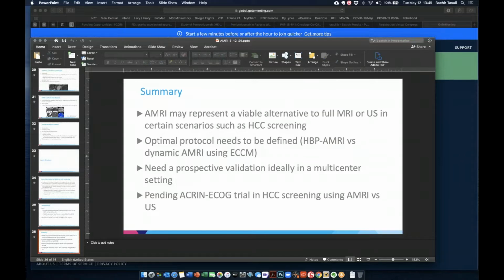So, if I get it right, this has been getting attention for a couple of years now. Right now I work in a smaller hospital. It's not a research institution. But we do have patients for whom it would be much more beneficial to have a shorter duration MRI. But there is really no precedent in private practice for doing this with the abbreviated MRI. That's still not being done countrywide.